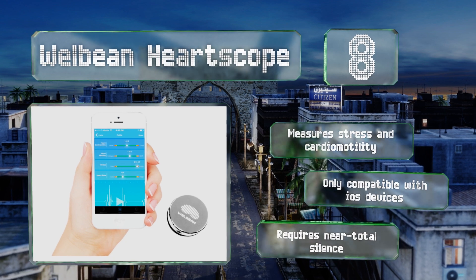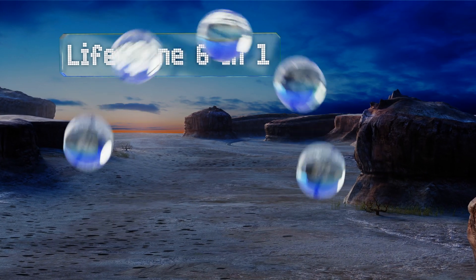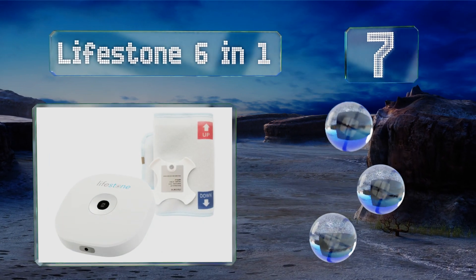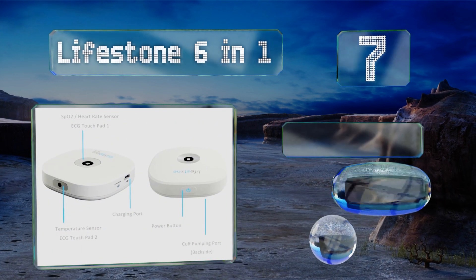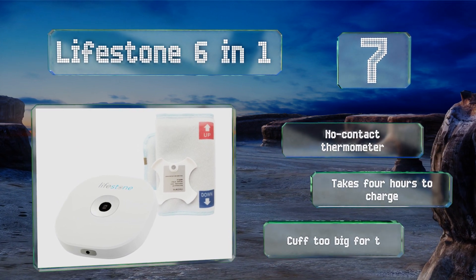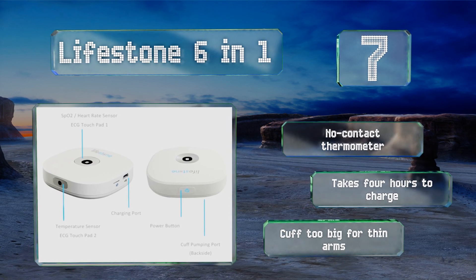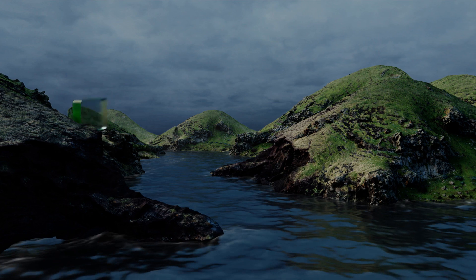At number seven, the Lifestone 6-in-1 keeps tabs on a variety of health markers including respiration rate, oxygen levels, and body temperature. While it's an intriguing device that may one day live up to its promise, it's currently plagued by a host of frustrating software issues. It comes with a no-contact thermometer, but it takes four hours to charge and the cuff is too big for thin arms.